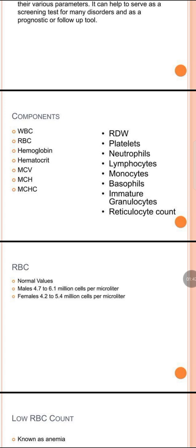These are very important markers when you are coming up with the type of anemia that someone is suffering from. I'll mention more when I reach the other side. But when you see that the MCV is lower than normal, you say microcytic.